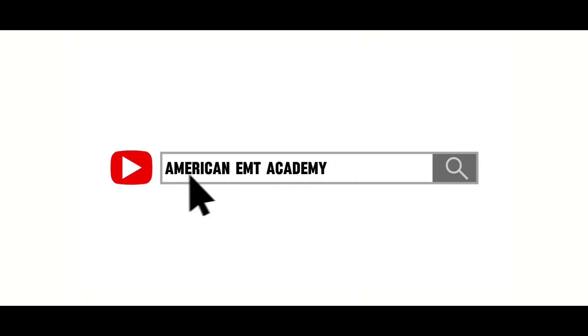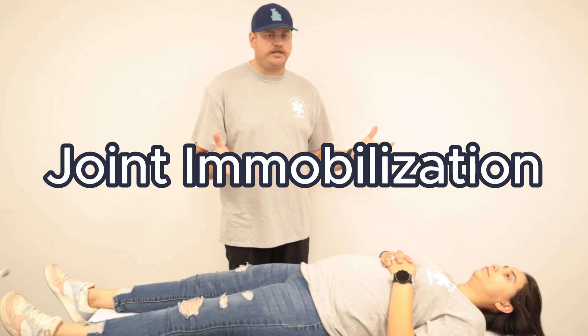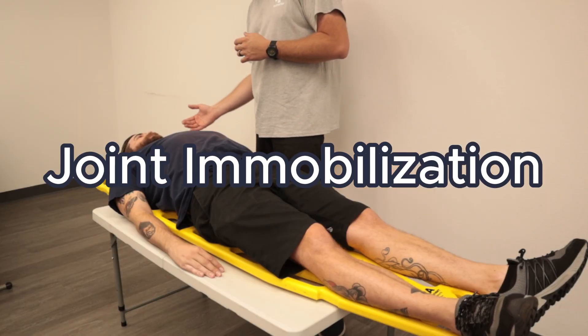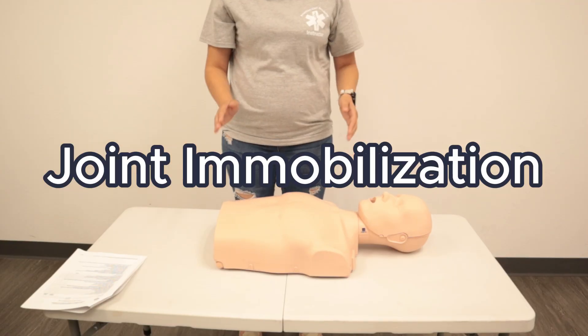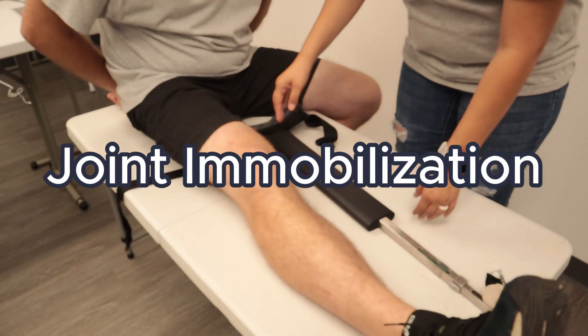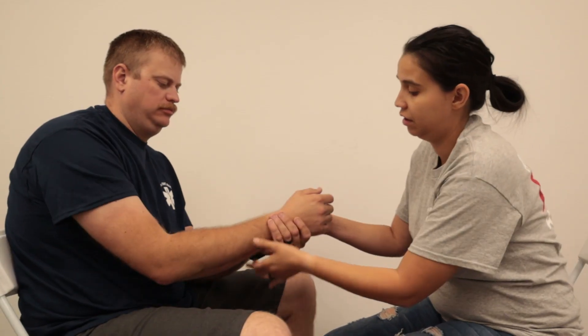This video is brought to you by S.T.A.L.A. For joint immobilization, we're going to pretend that the wrist is the joint that's impacted. Before we treat, we're always going to make sure BSI and scene safe — I have my gloves on and the scene does look safe. So what happened? I was running chasing after my friend after he pranked me and I fell.